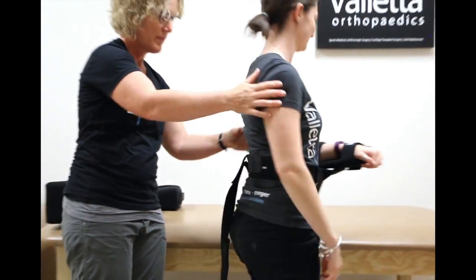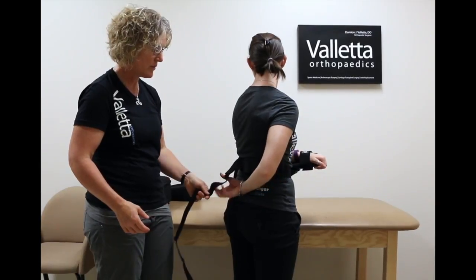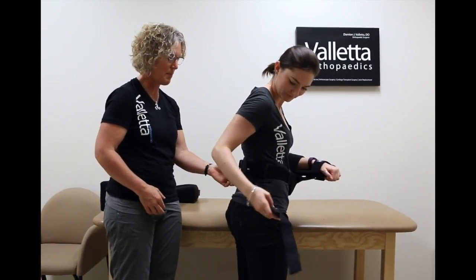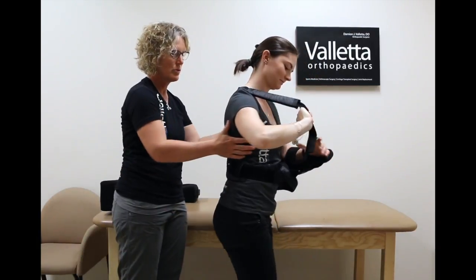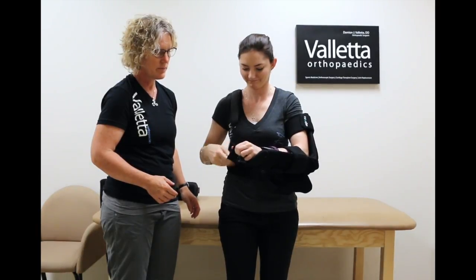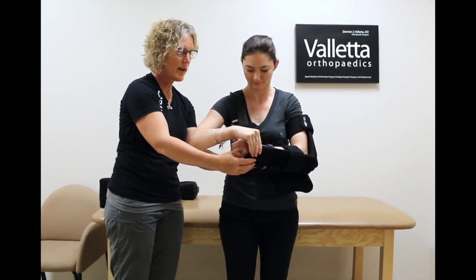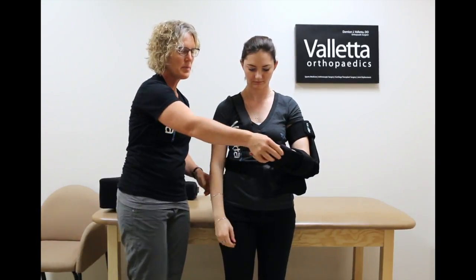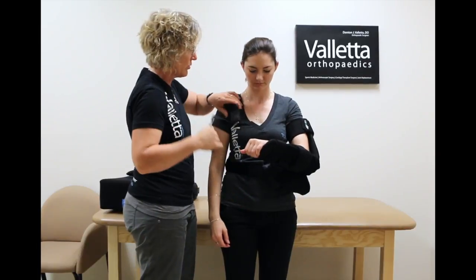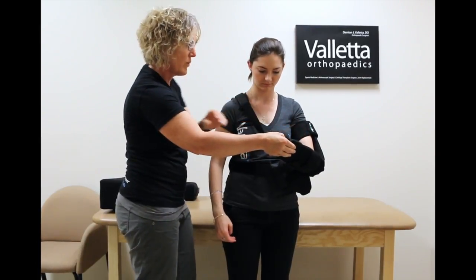Turn around. The strap that we've positioned so it doesn't fall off is nicely located right there. She's going to put it up and over her shoulder. Unhooking the Velcro, secure it down and underneath — it holds the weight of the arm. This strap is very important. If you don't have a strap, the arm will fall down. So you can make it as tight as you want to support the weight of the arm.